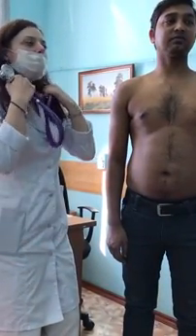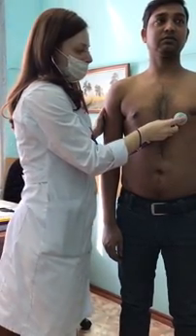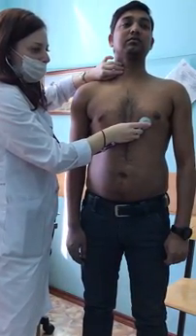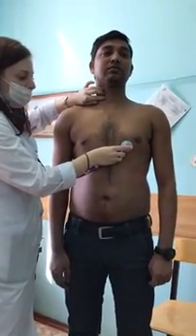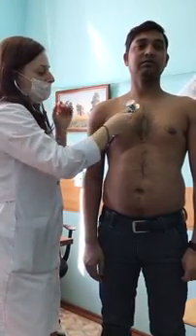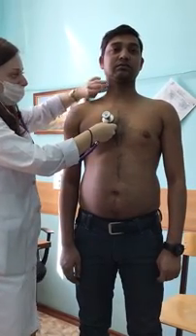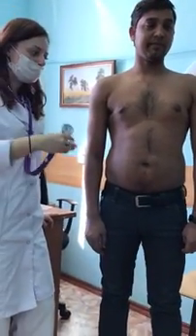At Botkin-Erb's point, the second heart tone is louder. You must remember how to differentiate the first tone from the second tone. We perform auscultation and palpate the carotid artery — the tone that coincides with the pulsation of the carotid artery is the first heart sound. If unsure at the base of the heart, palpate the carotid to identify which tone is first or second.